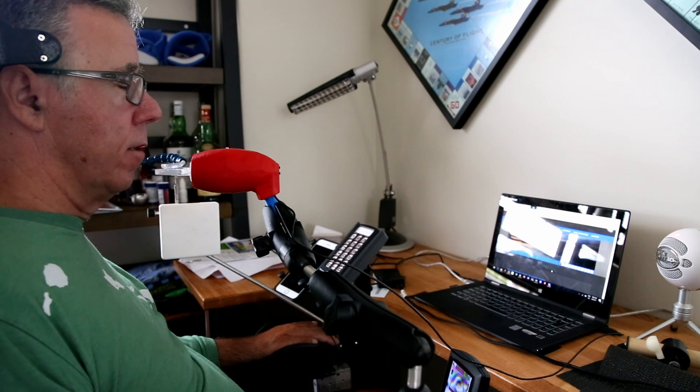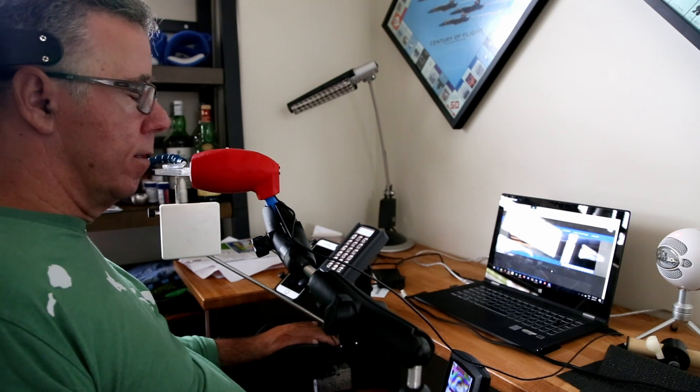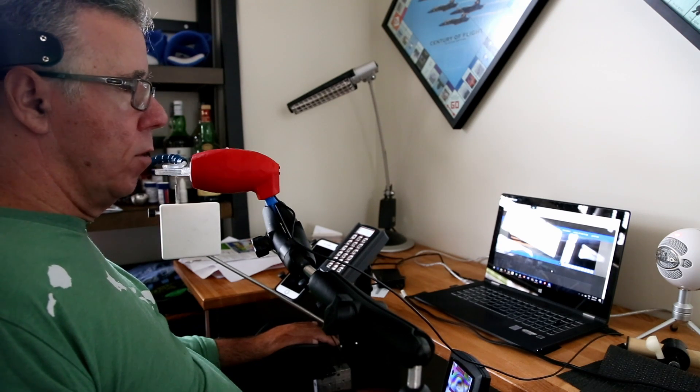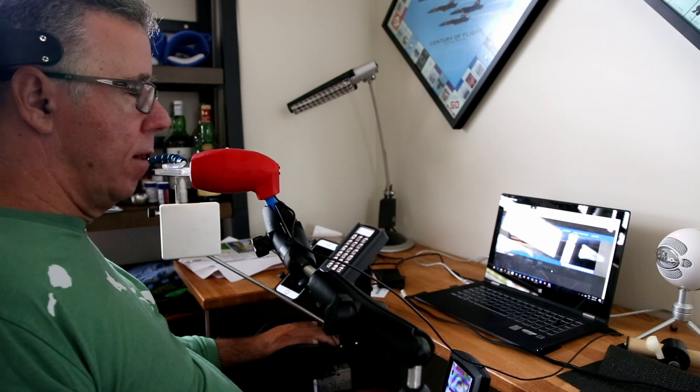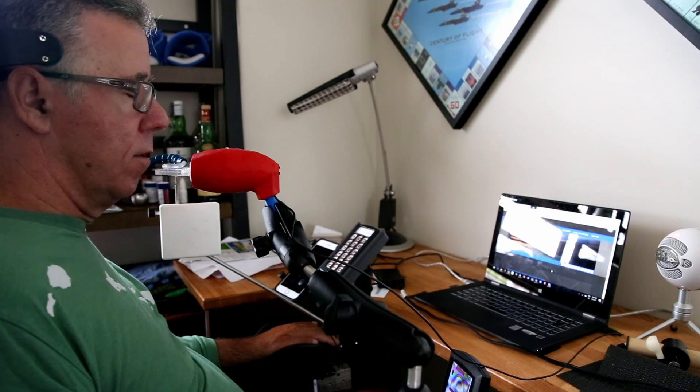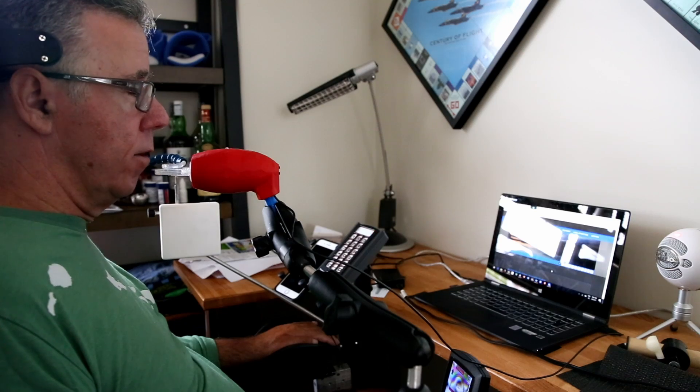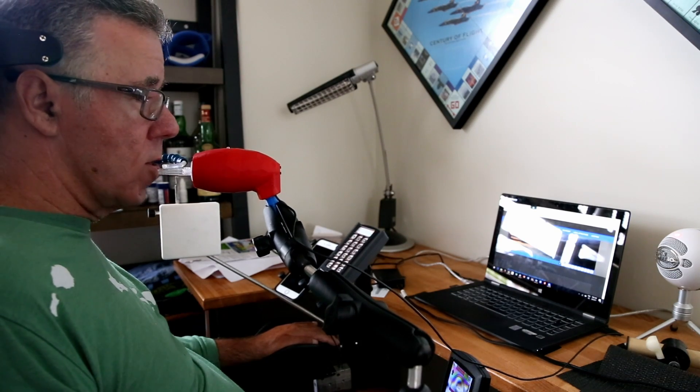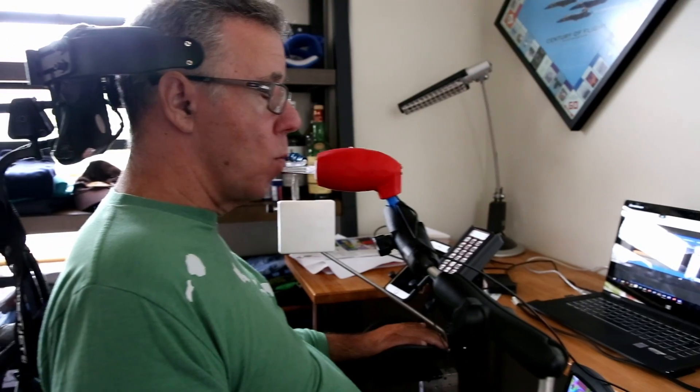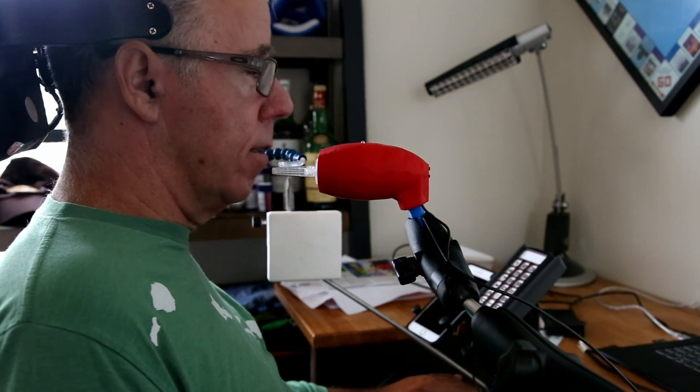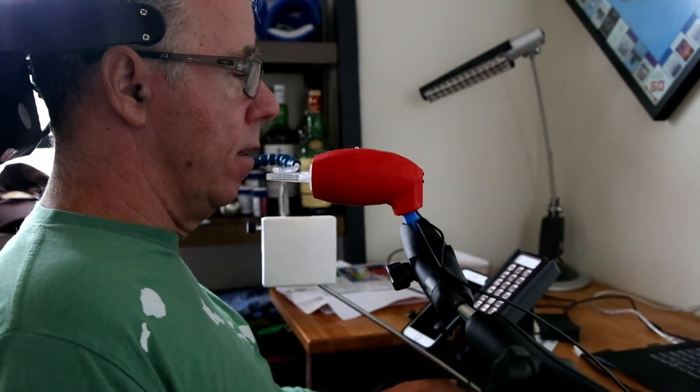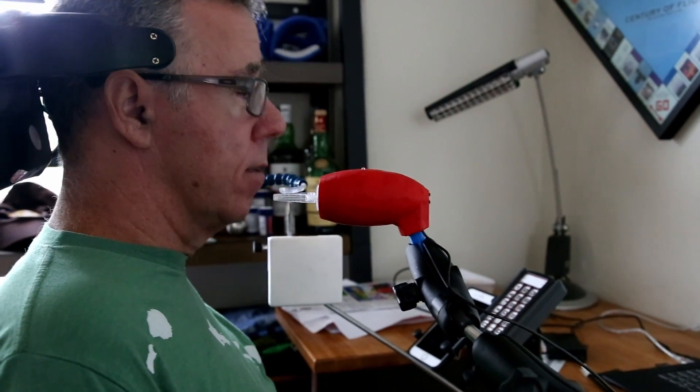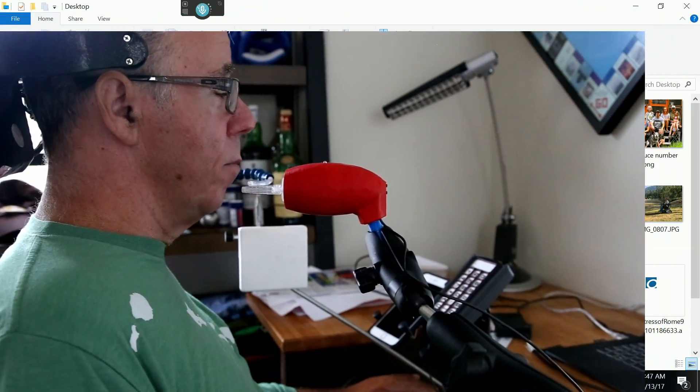So, this is called the Lip Sync, and it's a sip and puff, so I can blow or suck, sip or puff. And it also moves, think of a joystick on the old Nintendo games. And it works exactly the same, but if I puff, it's like a right click. If I sip, it's like a left click.